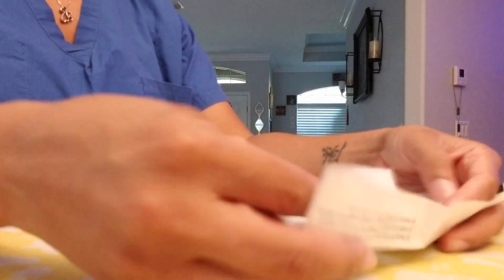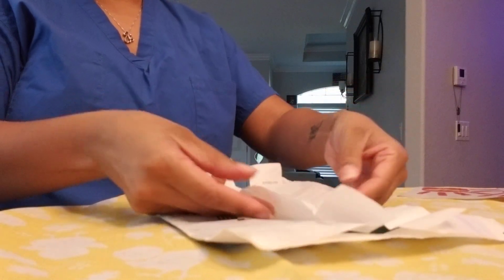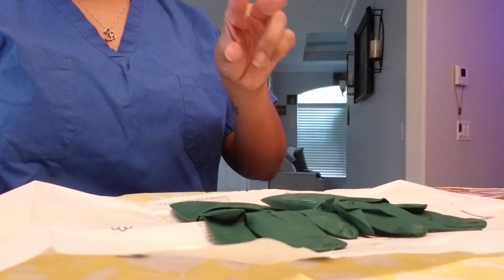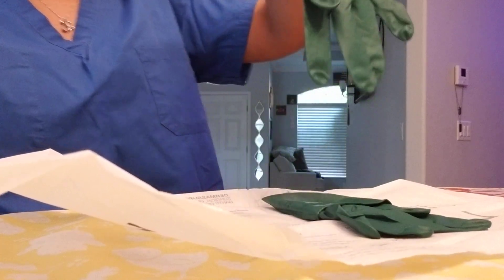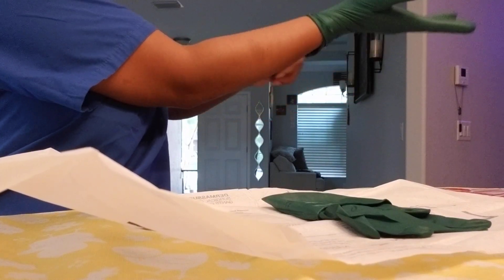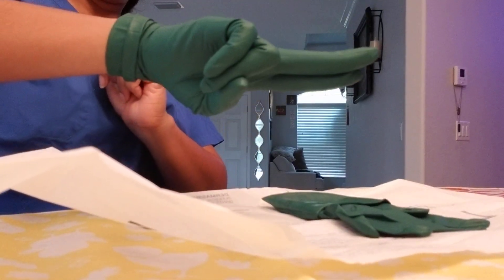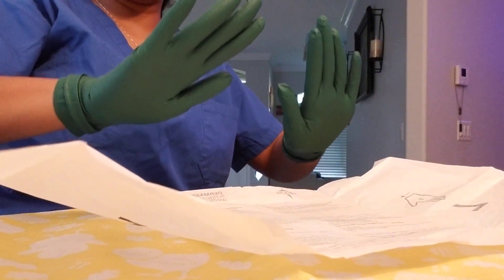Now we'll open the gloves again. Open it up with a nice little tent. Right hand — pinch the very edge of the cuff, come out and away, pterodactyl in, twist and pull. It rolled up so I don't have that cuff to pull back — leave it, no need to fix it. Bunny ears inside the cuff — pterodactyl, go in, away, pull out. No need to fix them; they're perfectly fine the way they are.